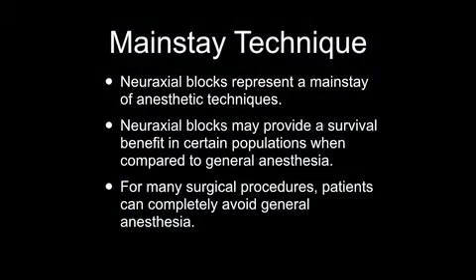Spinals and epidurals are critical procedures in the anesthesiologist's toolbox. Neuraxial blocks represent a mainstay of anesthetic techniques. Neuraxial blocks may provide a survival benefit in certain populations when compared to general anesthesia. For many surgical procedures, such as total joint arthroplasty, patients can completely avoid general anesthesia.